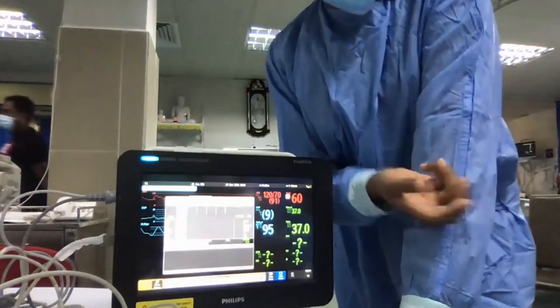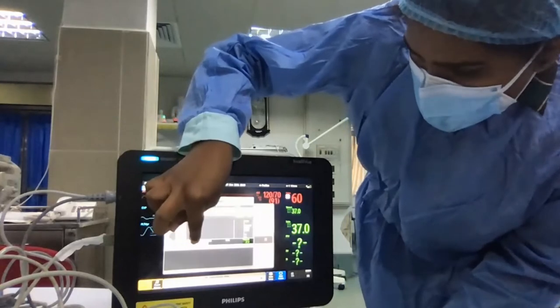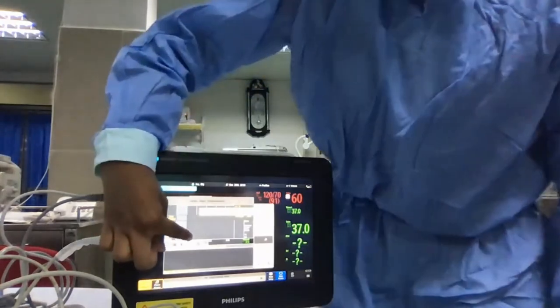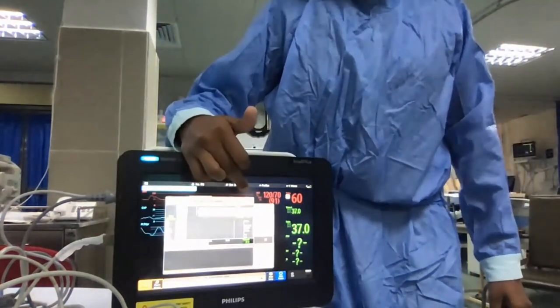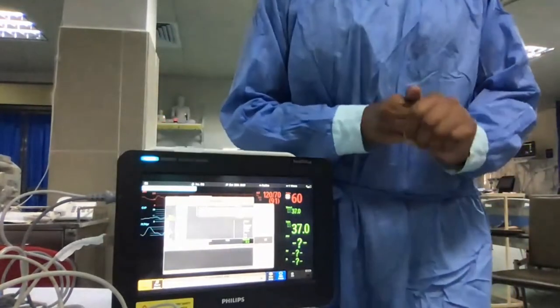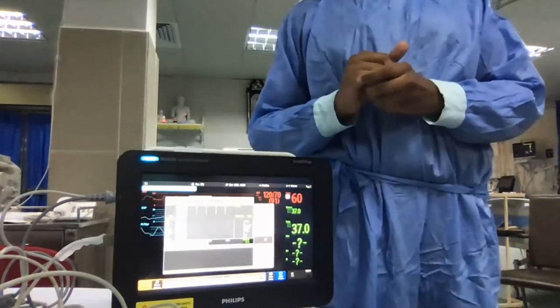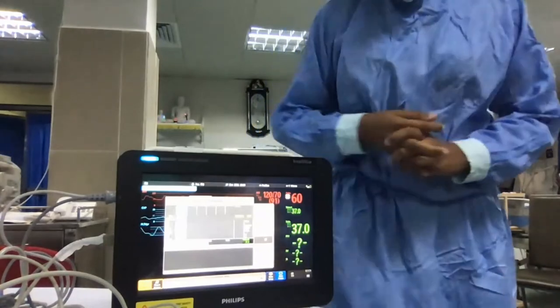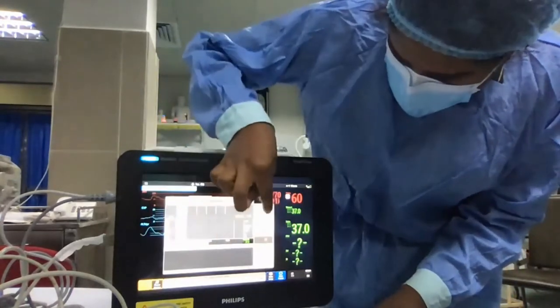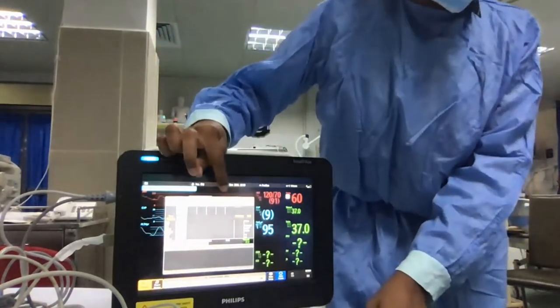If not, you can decide it. If you click here, injected volume, the recommended injected volume is 10 milliliters. So we have inserted 15, but the monitor is recommending 10 milliliters. Even 10 is enough so that we don't overload the patient. For example, with a pediatric patient, when we get the body surface area, we will get a lower injected volume. Then we are not overloading the patient. So you have to select it as 10, because that is the recommended volume.